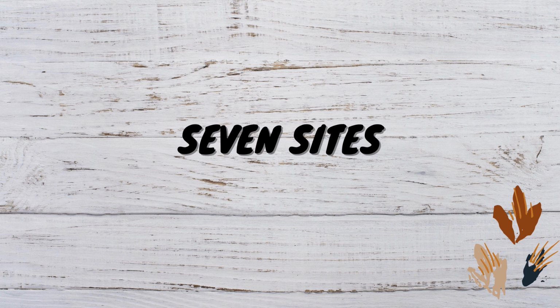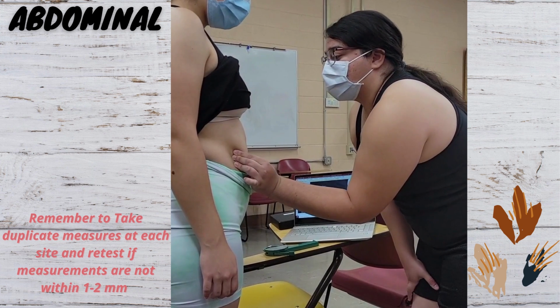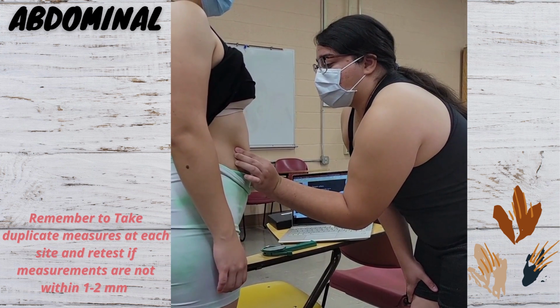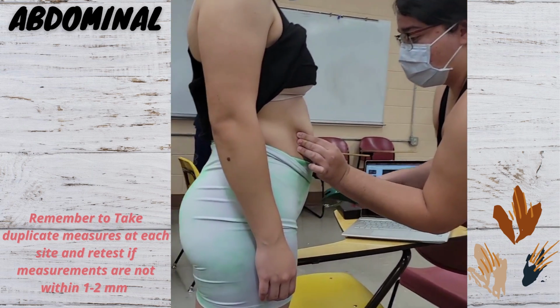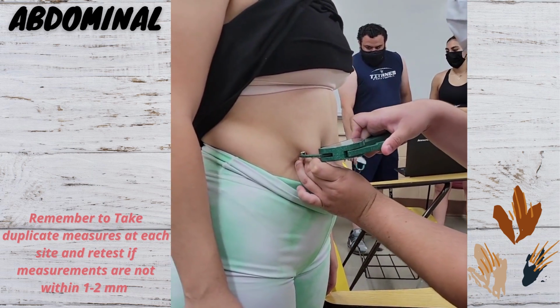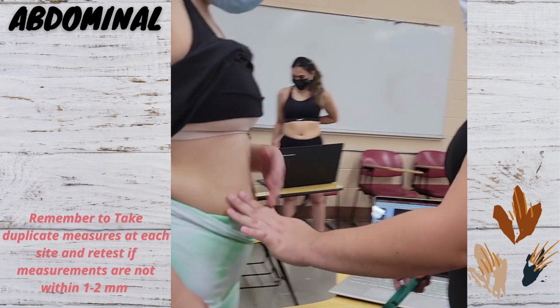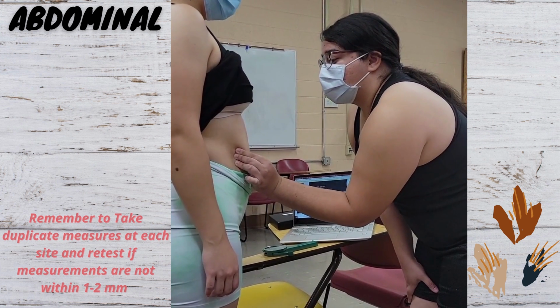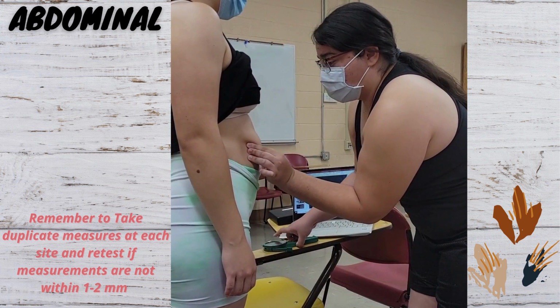There are 7 sites for skinfold measurements. When taking the abdominal site measurement, you'll need to pinch a vertical fold 2 centimeters to the right side of the umbilicus, or belly button. Use the skinfold calipers and place them directly on the skin perpendicular to the vertical fold. Maintain the pinch for 1 to 2 seconds, then read the measurement from the caliper.